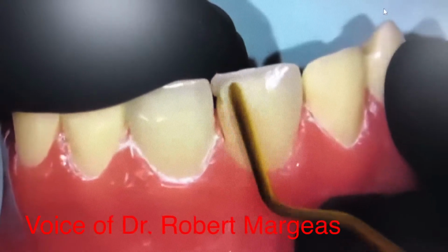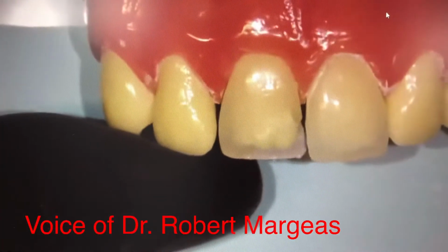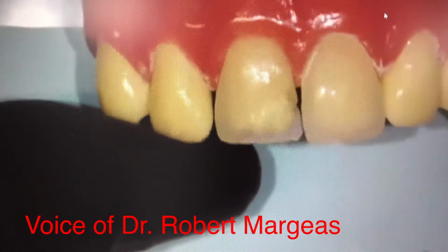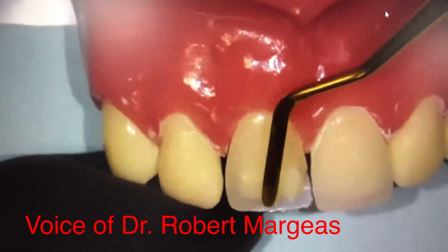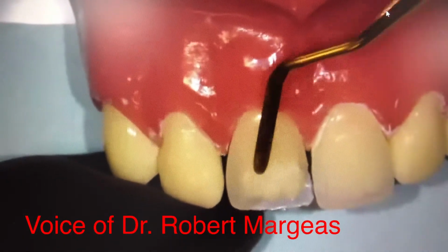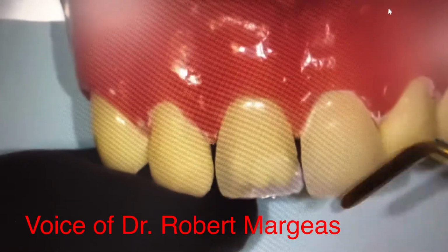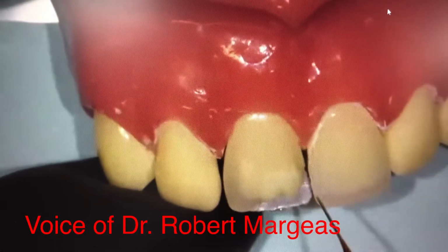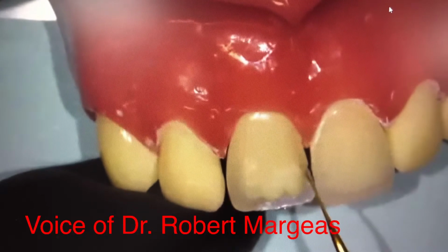And then I blend that in, so if I'm looking at this from the front, I want to create this little effect here, those three little lobes. So I can see the one that was already there, that would be that one, it's already there, so I'm going to create two here, and want to keep it out of the interproximal.